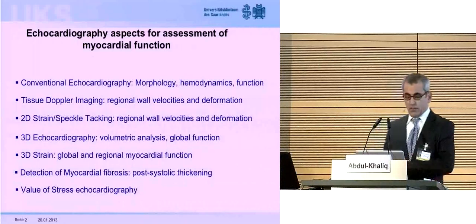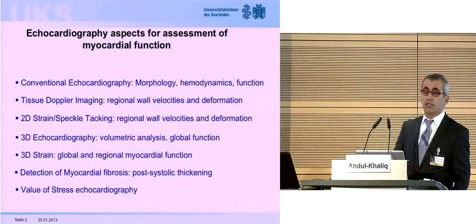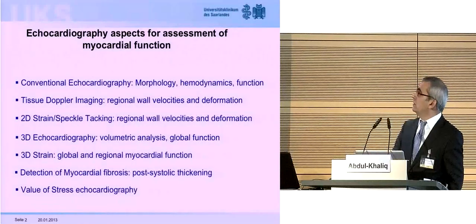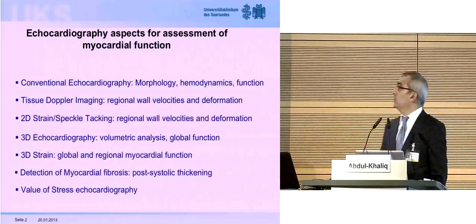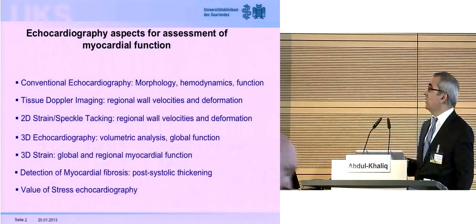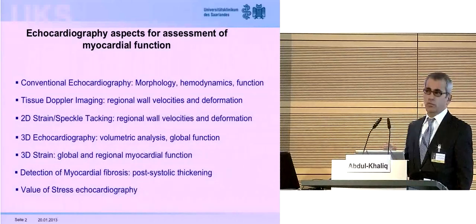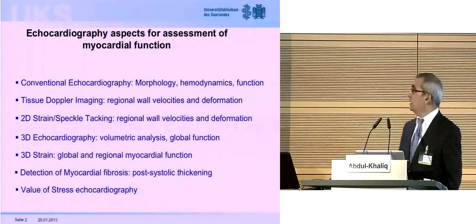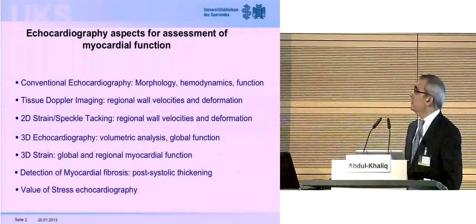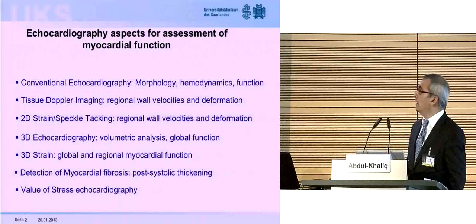I'd like to speak about this aspect concerning evaluation or assessment of myocardial function in patients with left ventricular pressure overload. And we have now not only the conventional echocardiography, including ejection fraction and inflow and outflow patterns, but we have also new methods, and we have to use it and to evaluate it in all patients, in pediatric patients, such as tissue Doppler imaging, 2D strain speckle tracking, and the newly developed 3D echocardiography and 3D strain.